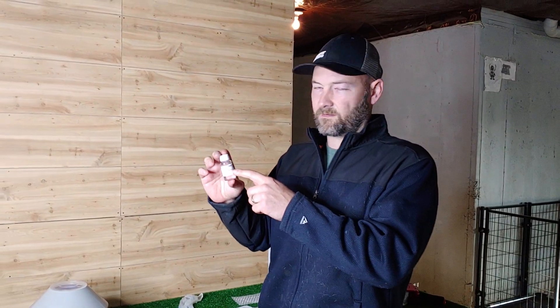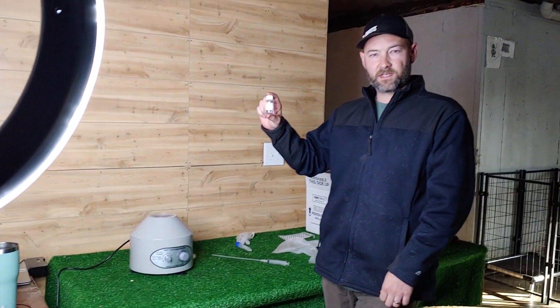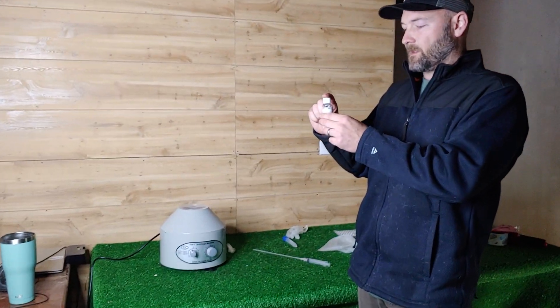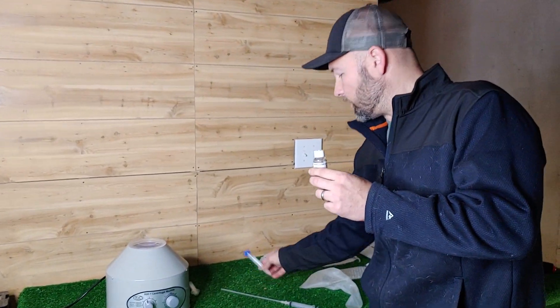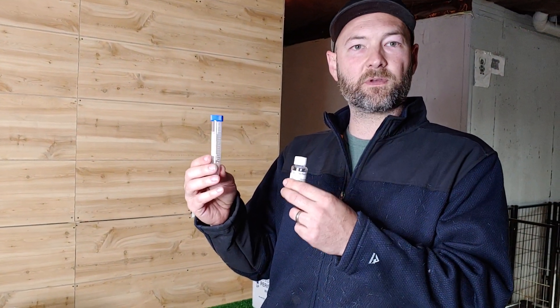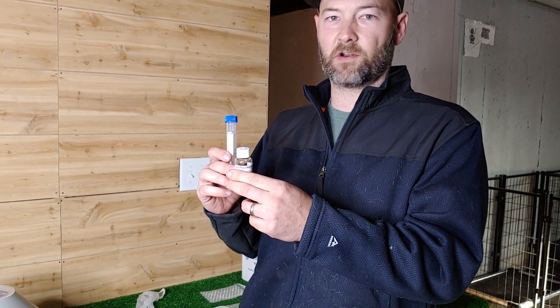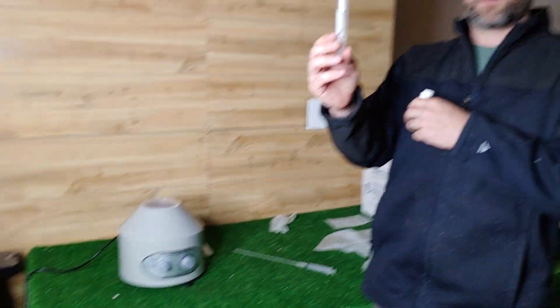One thing to note: because it's in the fridge, on the day that you're doing your breeding, you want to put four milliliters in a container and let it get to room temperature. You don't want to add cold semen extender to the semen or you could shock it and kill it. I've already brought it down to room temperature here.